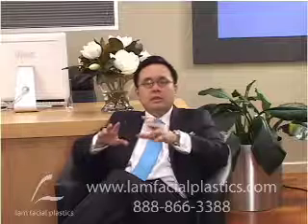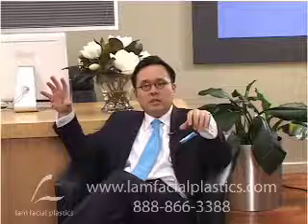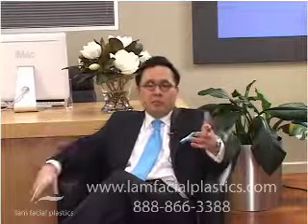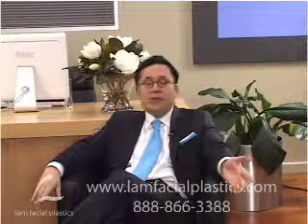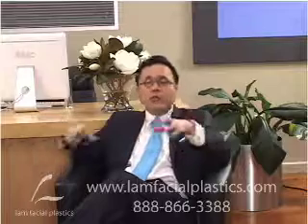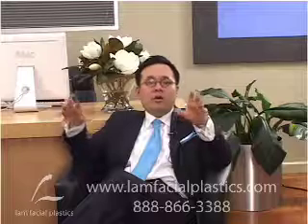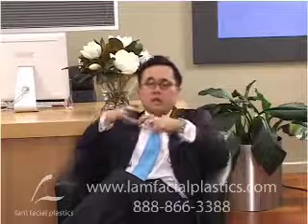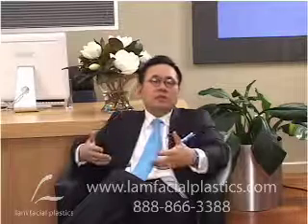Even Juvederm and Restylane is somewhat hard, but you take that spectrum of hardness and you go to the implant side, the solid implants, it just feels like rocks. If you don't believe me, ask someone that you know that has had a solid implant, and feel it. And I don't care which one they've had, it feels hard. I felt the new ones, the new VERAFILs, I felt the old ones, I felt everything in between, and they're all hard like rocks. They feel like a solid silicone breast implant that just has encapsulation. It just feels like a rock, and there's no shape and design work.